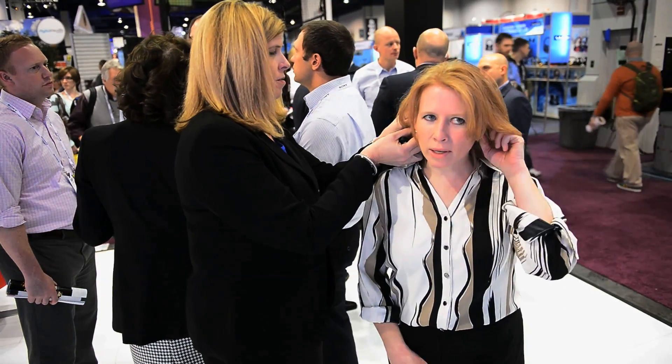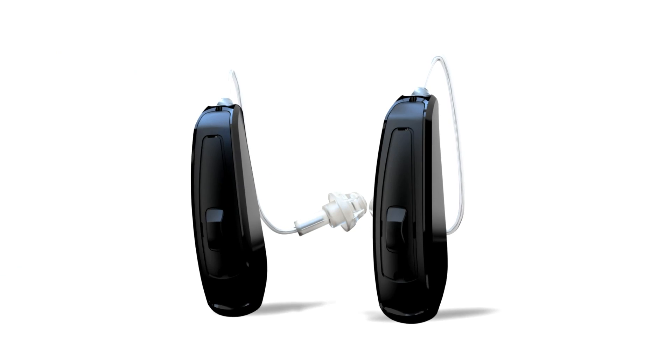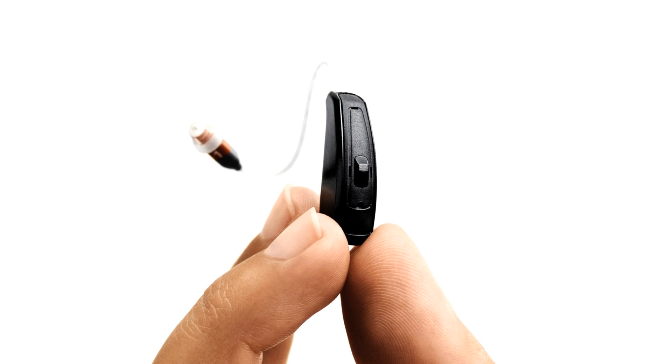In fact, with our new receivers, we can fit 90% of hearing losses. ReSound LiNX has the great sound quality that you would expect from ReSound. As a matter of fact, we're proud to say that we were rated number one in an independent test among sound quality in all major manufacturers.